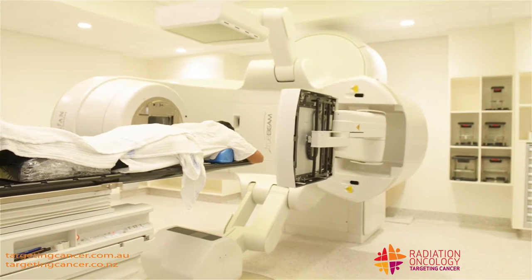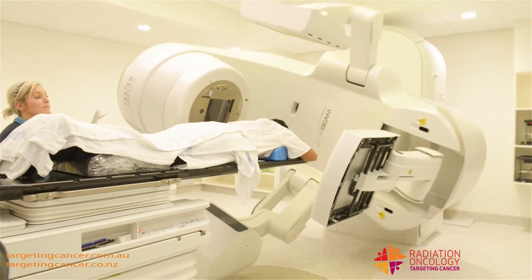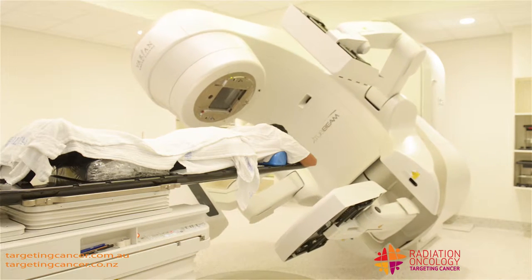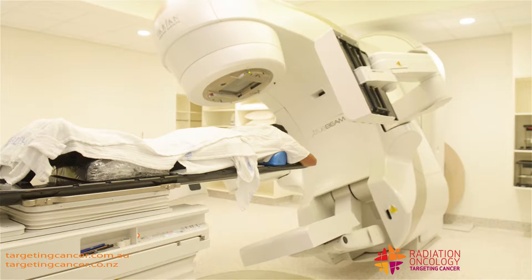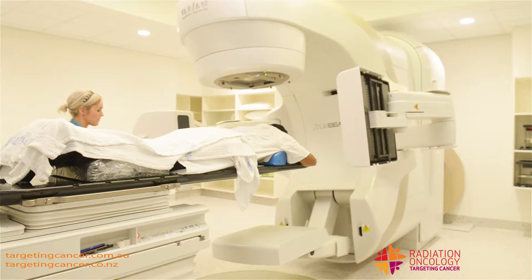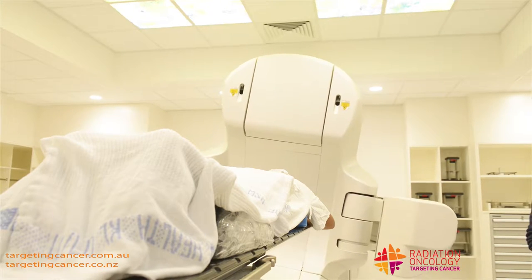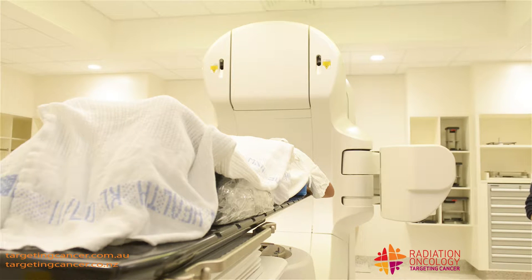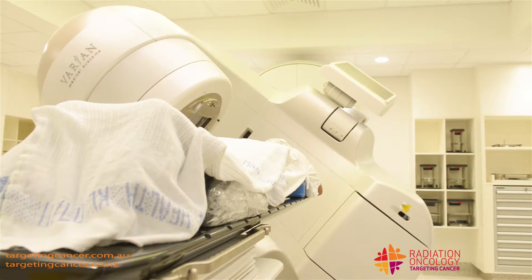As you can see, everything can move around a bit. I'm just going to move this back to the top and take the arms out. So if John couldn't lie on his tummy, we would get him to lay on his back instead. The patient never moves during the treatment — we always move the machine.